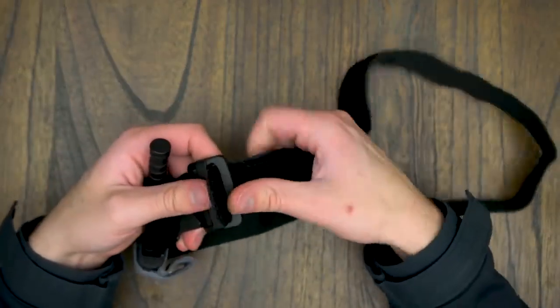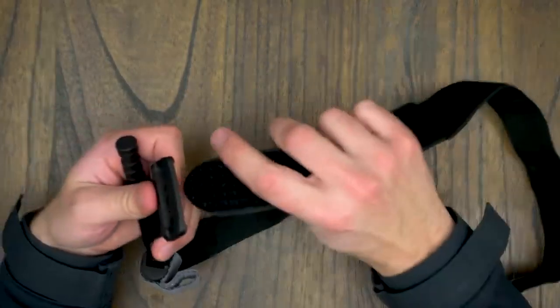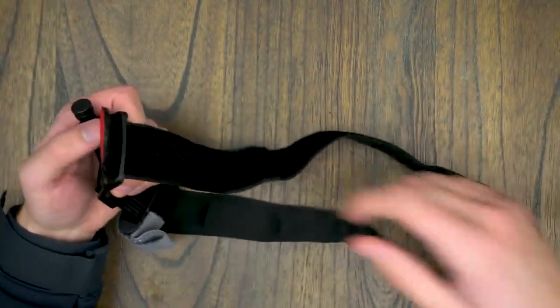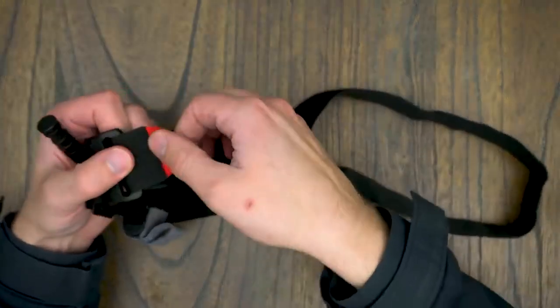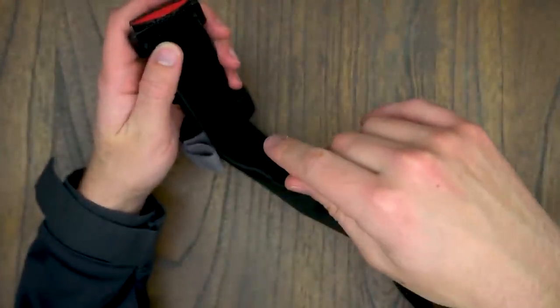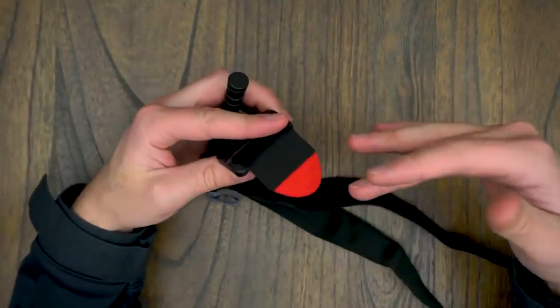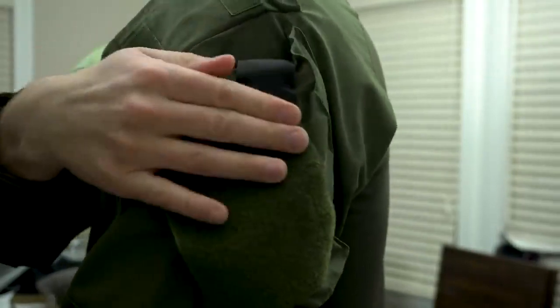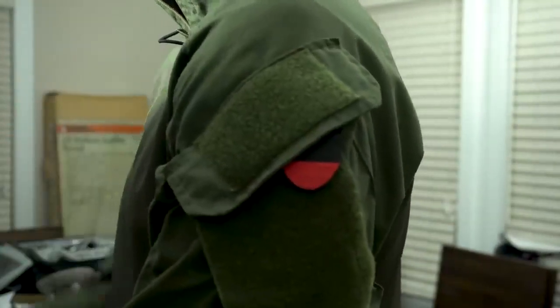So you can really quickly pop this out, take it off if you need to put it on a leg, or just take it off and tighten it really fast. The other advantage this gives you is, while it's in that form factor, if you have to put this tourniquet in an enclosed pocket, either on the shoulder of your combat shirt or in a cargo pocket, you can take this red tip and this can actually hang outside of your pocket. So people around you know that you have a tourniquet on you.